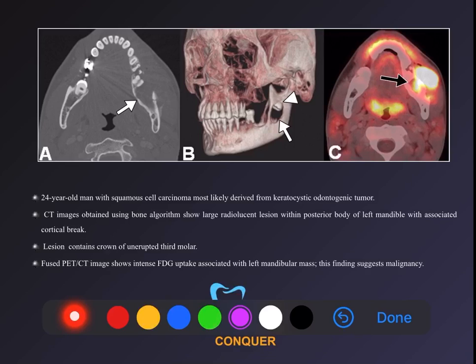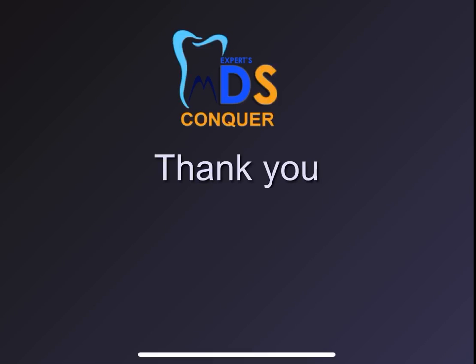They can post the picture, they can also give you the clinical presentation, and they can give you many options based on that. First you should know how to identify the abnormal area, then you arrive at the diagnosis. First you need a good idea of all the cysts and tumors related to the head and neck. Then if a CT image is given to you, it will be quite easy to arrive at a particular diagnosis related to that image. So this is regarding the interpretation of CT.